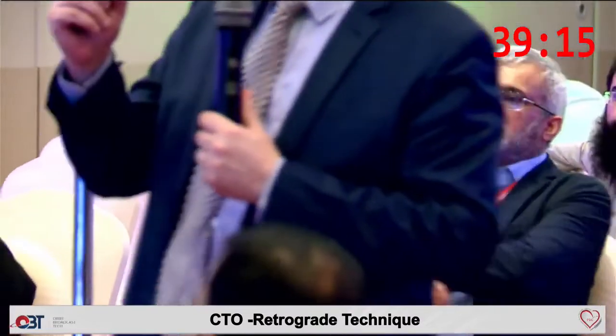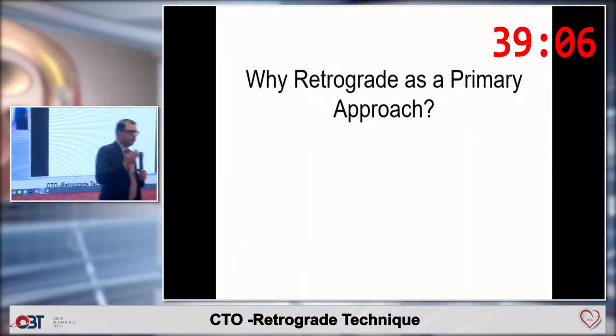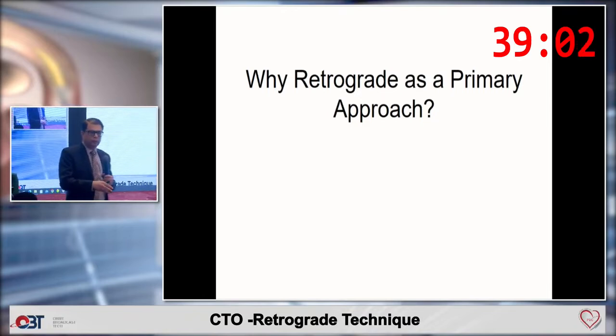Once you've got a perforation of an epicardial collateral, you first do balloon tamponade to stop the bleeding until the time you take another guide. So balloon tamponade is vital, even if you have to put in a coil. So you do a balloon tamponade and try to avert an emergency and slow down the bleeding, take another guide, do a ping pong technique, and if it's a large perforation, it is better that you take another guide and put in the coil.